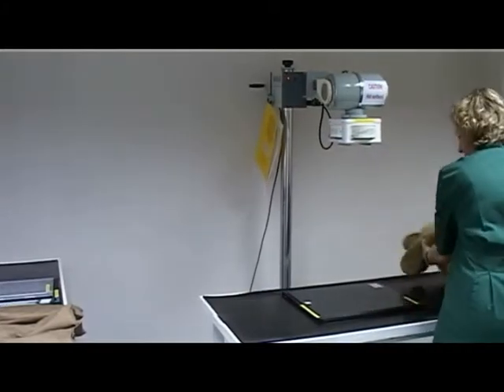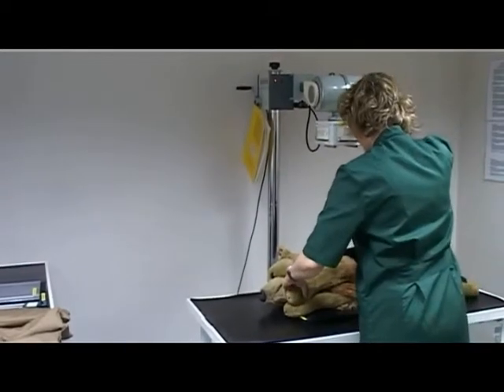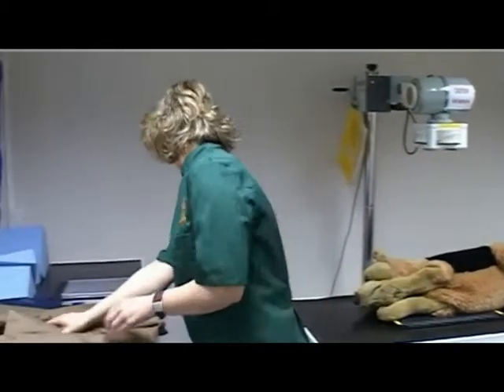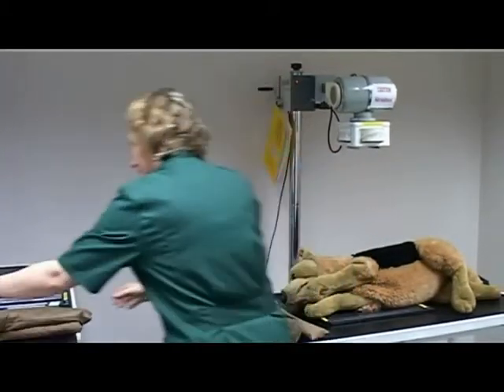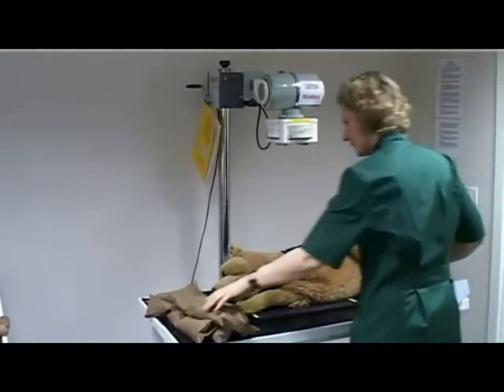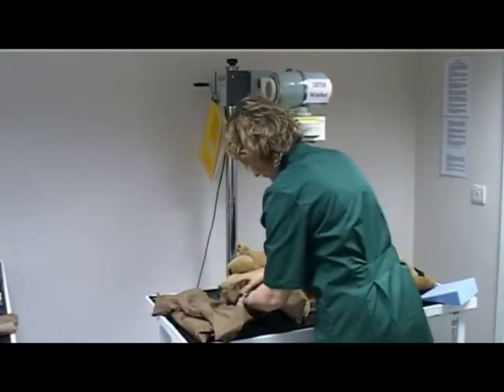Place the patient in lateral recumbency with the thorax positioned on the cassette. Select the positioning and restraint equipment needed. Extend the forelimbs cranially and secure each limb with a sandbag.